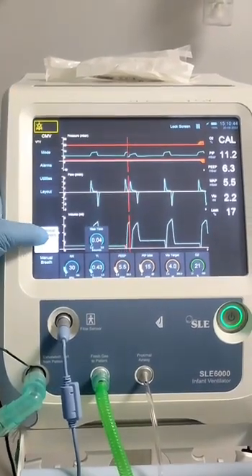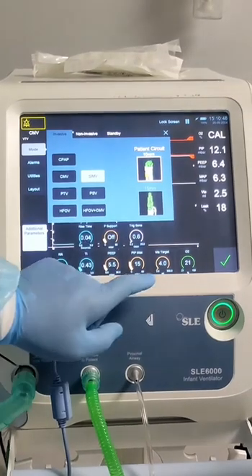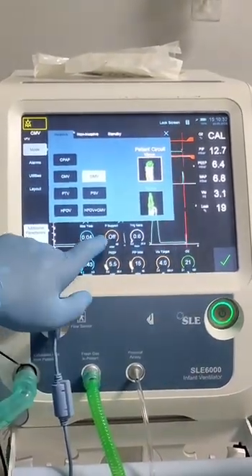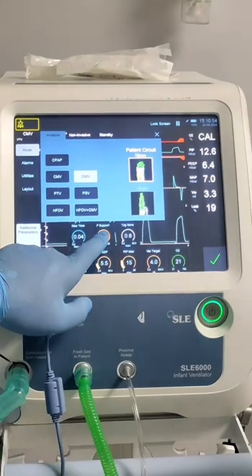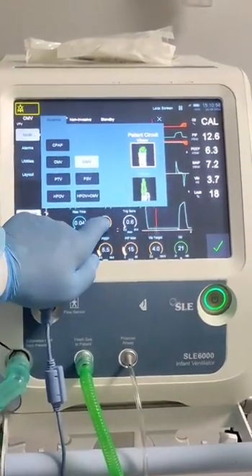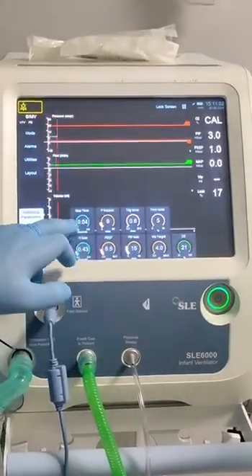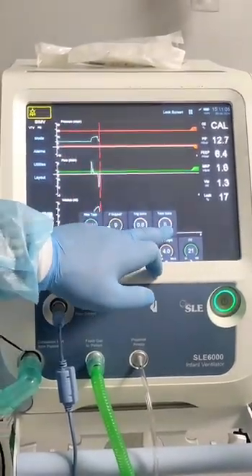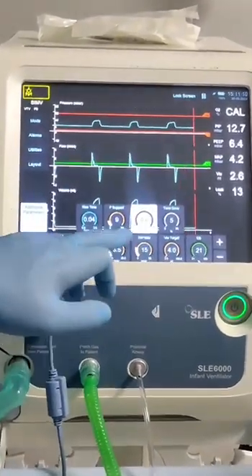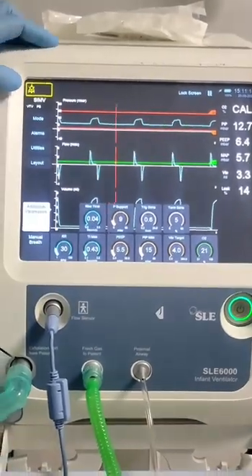If you want to switch to CMV, you can choose the settings from here. We also have an option for pressure support — you can switch it on or off and choose how much pressure you need. Also: rise time, termination sensitivity between 5 to 50, trigger sensitivity between 2 to 20, and pressure support between 0 to 66.